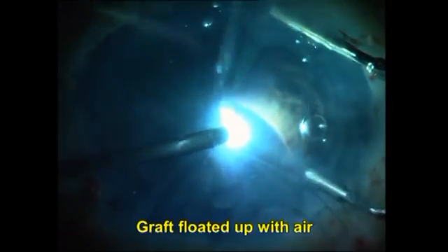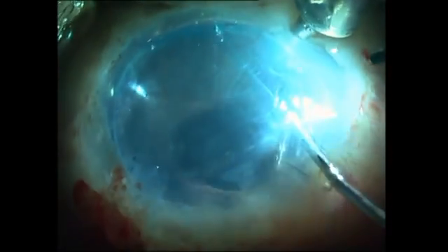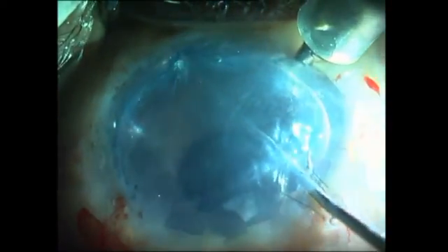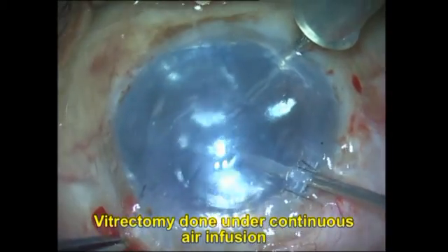I go ahead and center the graft into position before floating it up. Once I have unrolled the graft completely, I inject air underneath it through a cannula inserted under the graft. Once the air is in position, I start the air infusion again through the anterior chamber maintainer, and you can see it helps by preventing graft dislocation even when instruments are entering the eye.